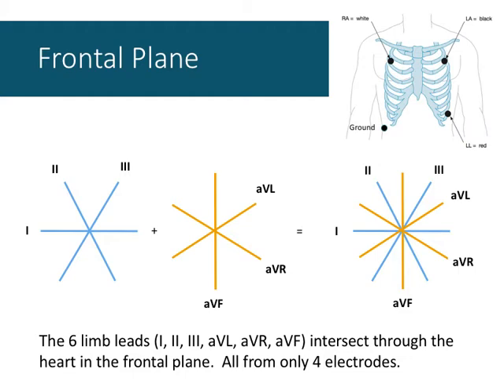You also know which ones are which by the names. Anything with the AV prefix is augmented voltage. 1, 2, and 3 are physical. And maybe physical leads is a better way to describe it.